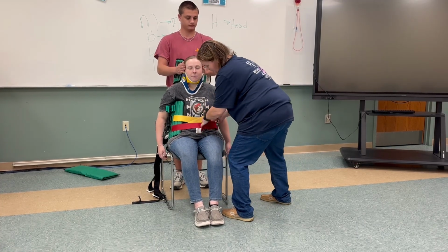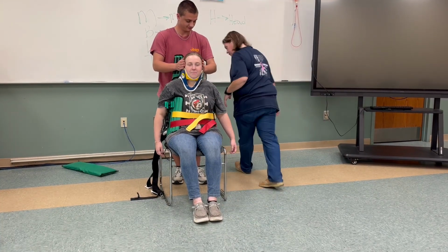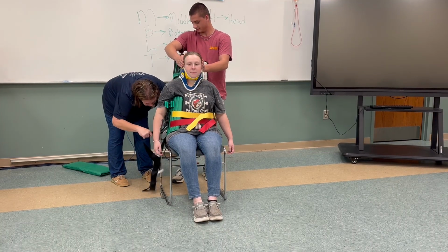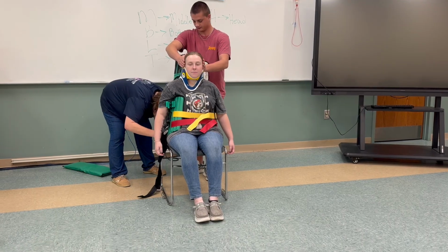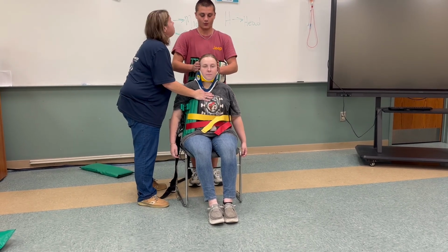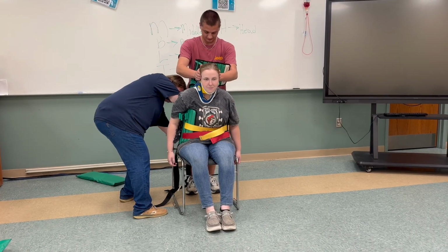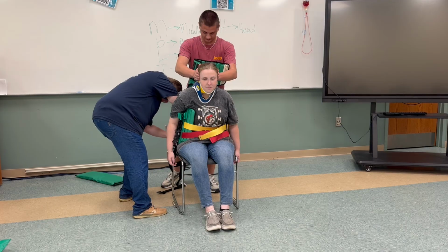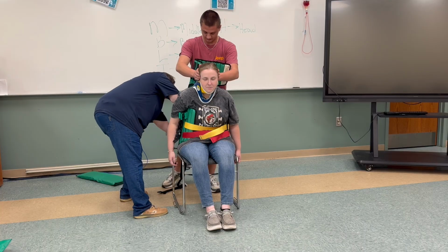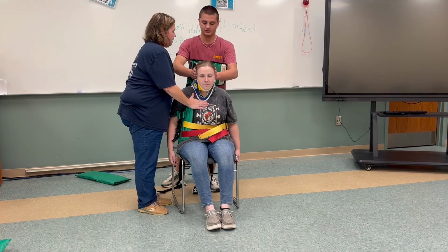It's going to be tight, ma'am, okay? All right. Now we go to the legs. And unfortunately, sometimes your legs get behind the patient where you have to move it. So it's proper. All right, we're going to have to move you up one more time so I can get my things. Ready? 1, 2, 3. All right, perfect. Thank you. Hold on. All right. There we go. All right. On your count, sir. 1, 2, 3. There we go.